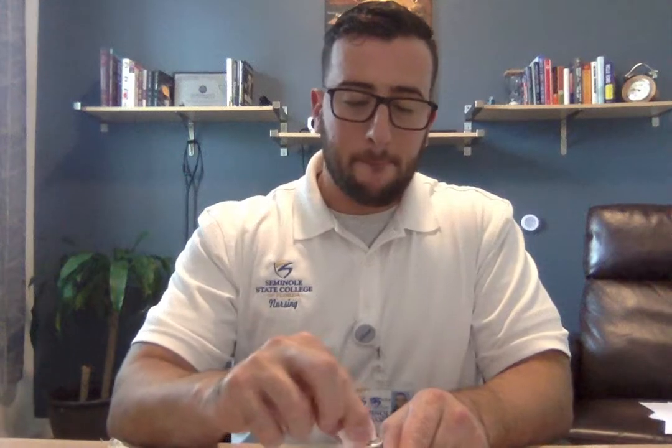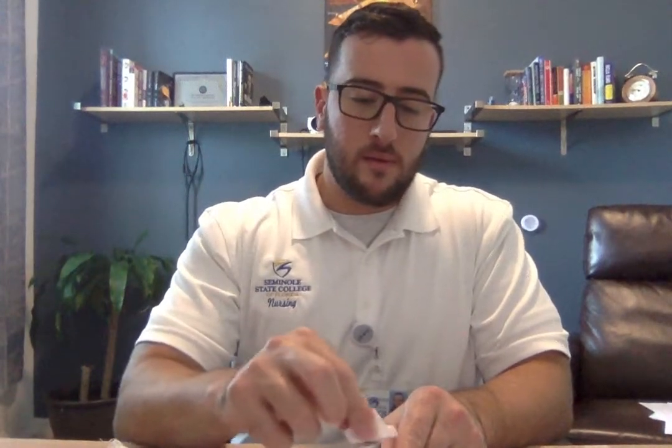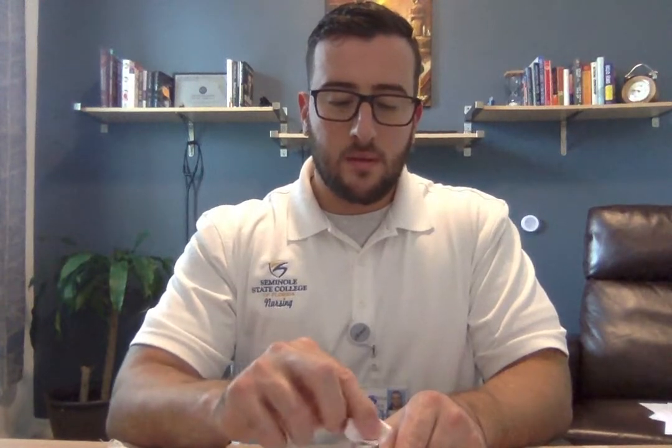All right. Next thing I want to do is open up my alcohol pad. I'm going to clean this for 30 seconds. Okay, I'm going to go ahead and place this here to the side. I'm going to leave the alcohol pad on top. That way I know that I've already sanitized the top of that.